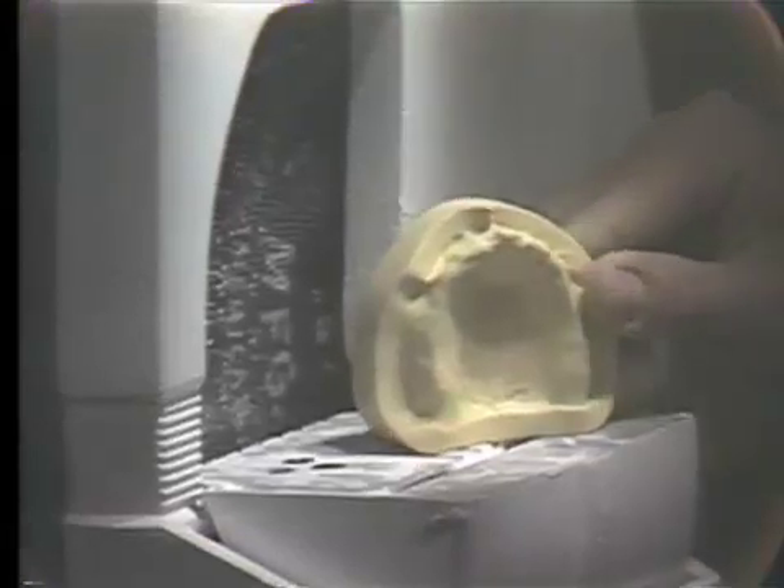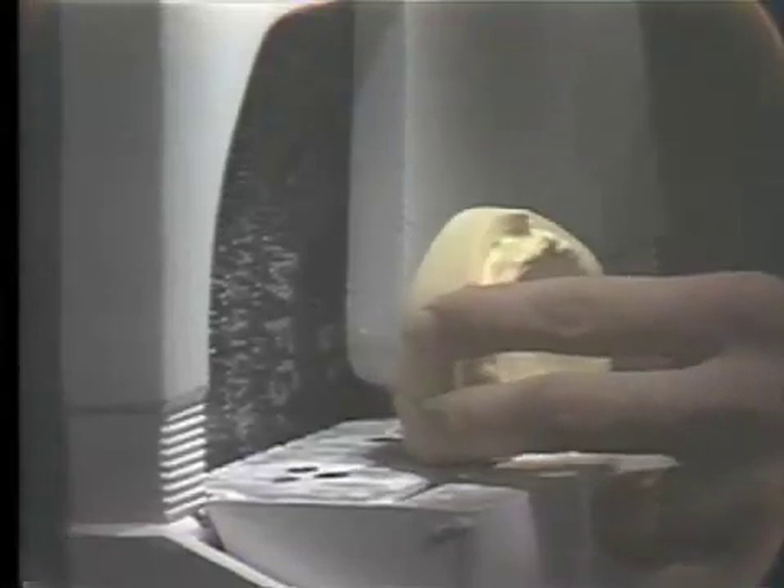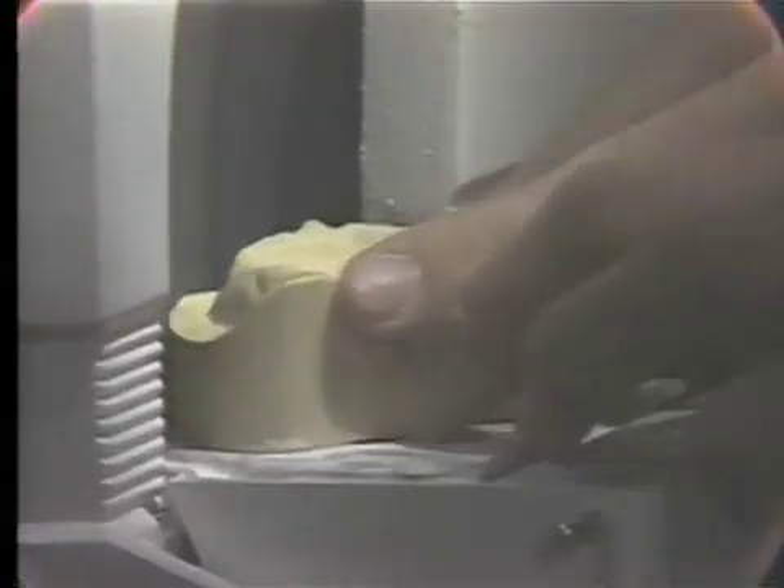After removing all of the plaster and pumice mixture and the residual wax, we are prepared to trim this model on the model trimmer. The first thing we should do is trim the inferior border of the stone model and adjust this to approximately one half inch in thickness or height. After we have attained this thickness, we then begin to adjust the boxing edges of the model to approximately a quarter of an inch in width.